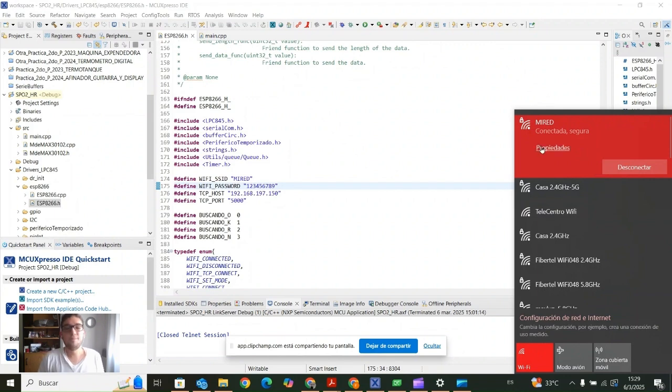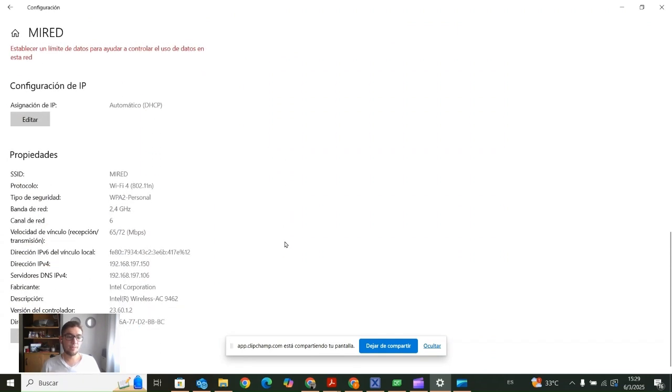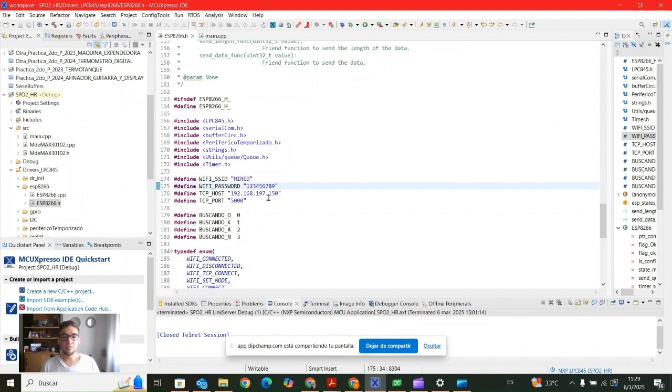Then we go to properties and we look for the IPv4 direction. This one. We are going to copy and paste and replace it here. Of course, I have the same because I already did this before the video recording, but you should copy the direction and write it here. Then the TCP port. The TCP port can be any port that you want, except for those that are already being used by your computer. Typically, 5000 is a good number to choose among different ports.